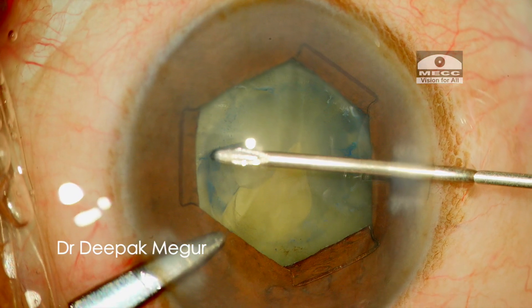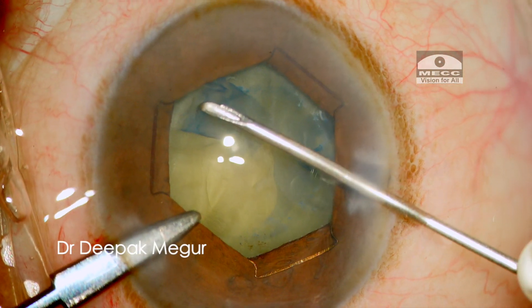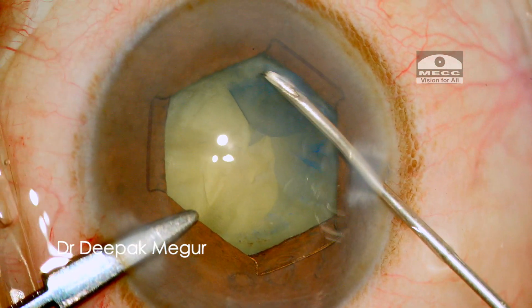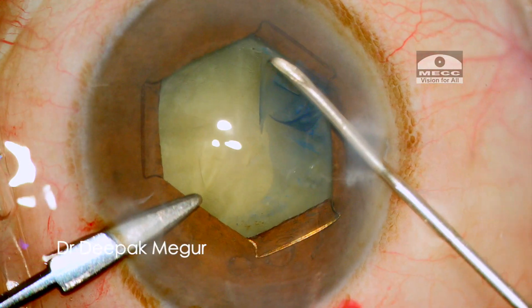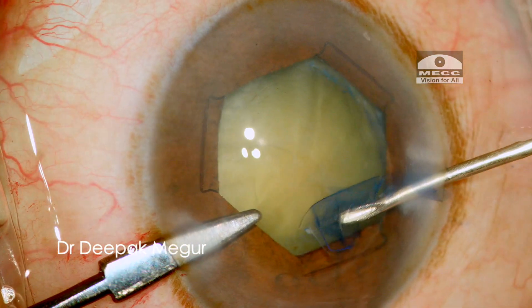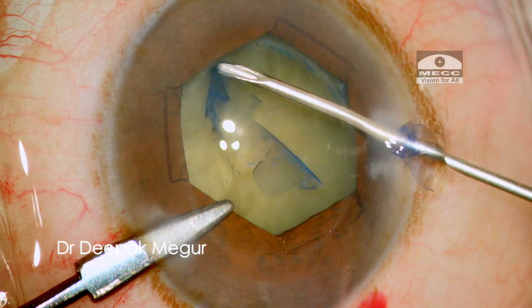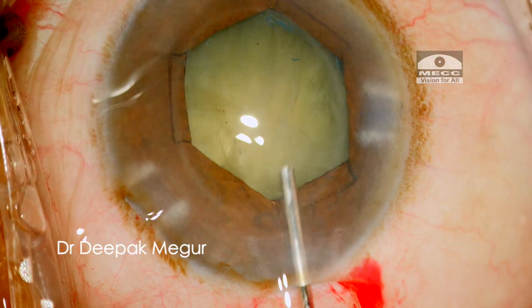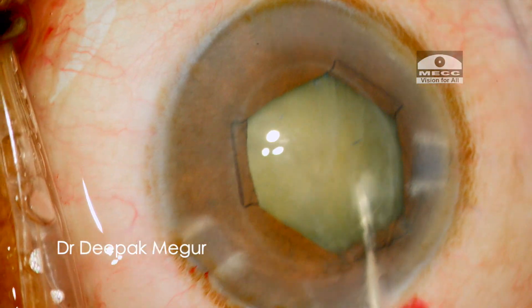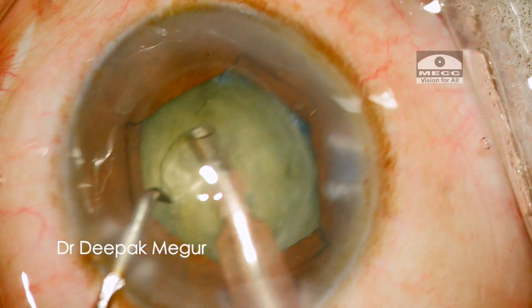The rhexis is now being performed — it's about 5.5mm in size. Hydrodissection is then performed. The nucleus is pressed down to release any underlying trapped fluid, and then gently rotated to ensure that it is totally free from its attachment to the capsule bag.